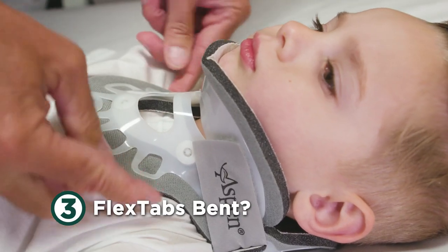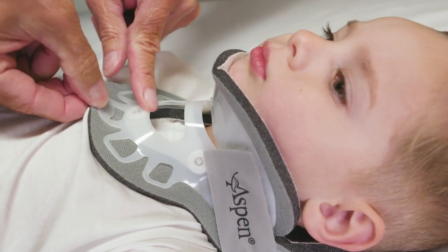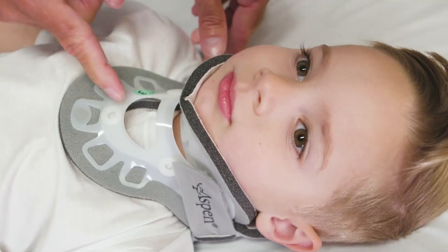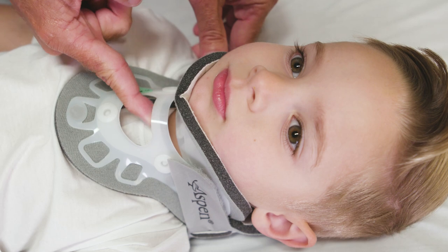Third, are the flex tabs bent? If the collar has been properly sized and tightened, the flex tabs will be loaded to spread the support. Please note that the inner trach bar should never touch the airway.